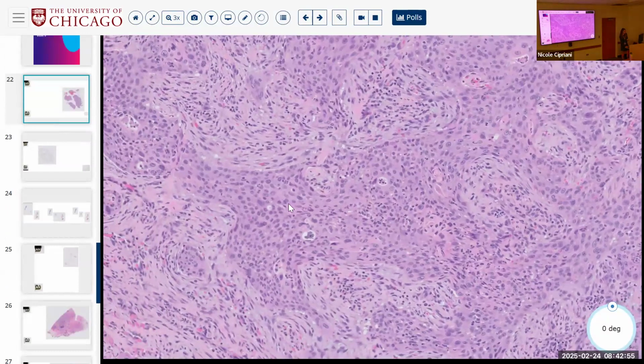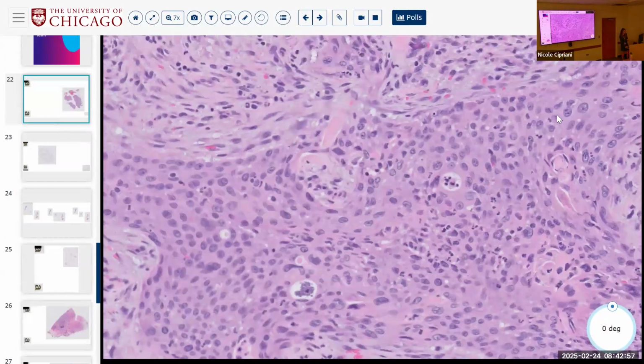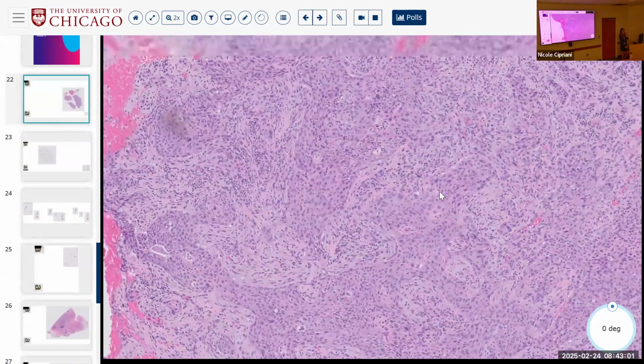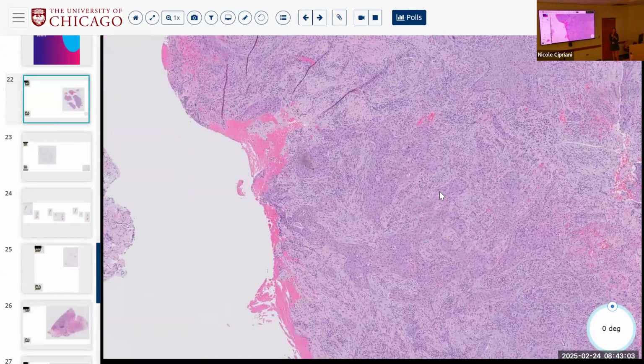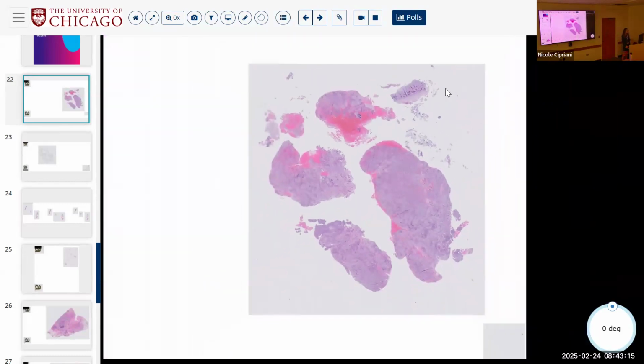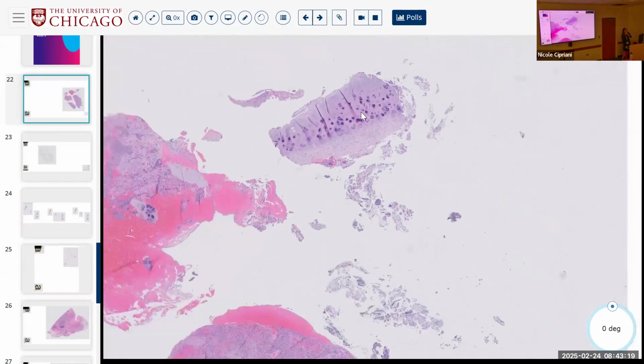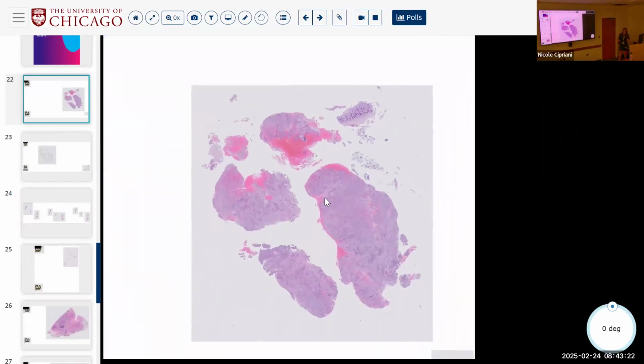What does it look like? If I didn't tell you this was thyroid or thyroid area, what does it look like? Squamous cell carcinoma, right? So when you are dealing with a thyroid or a thyroid invading trachea, which is what this is, and it looks squamous, this is probably squamous anaplastic. So this is not a laryngotracheal, look, here's tracheal cartilage.